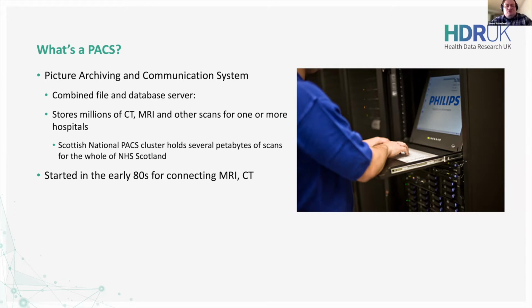Our most recent projects pulled more than 35 million files for one single project alone, which, as you can imagine, is causing our infrastructure people some hair loss. And projects only get bigger from that. For Scotland in particular, there is conceptually a single PACS cluster that covers the entire country, although it's organized, there are devolved aspects for each region.